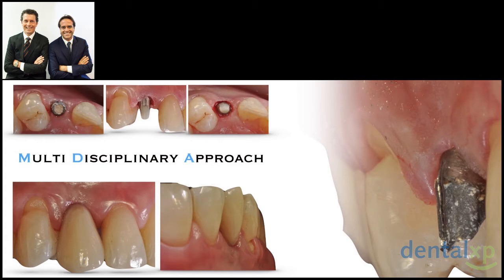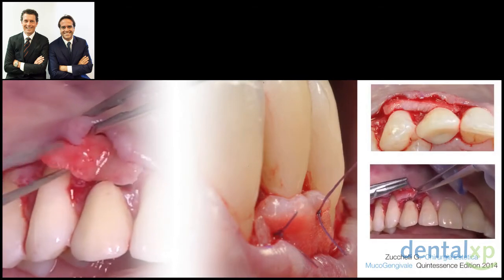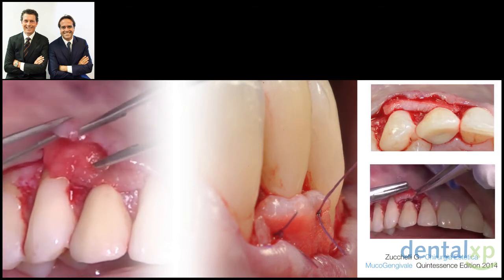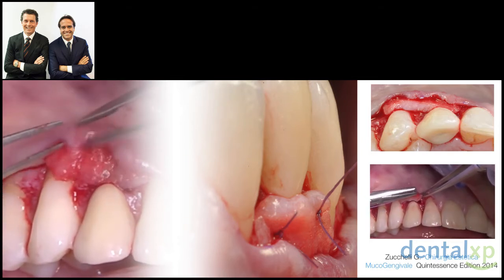To solve this, the existing implant crown was first removed, and the implant abutment was reduced and re-prepped palatally to recreate a space, and we applied a new provisional crown, starting to condition the soft tissue. To optimize the final result, it is a must to thicken the soft tissue. One month after, a bilaminar technique was performed, consisting of a coronally advanced flap covering a 2 millimeter thick, dense and white connective tissue graft.